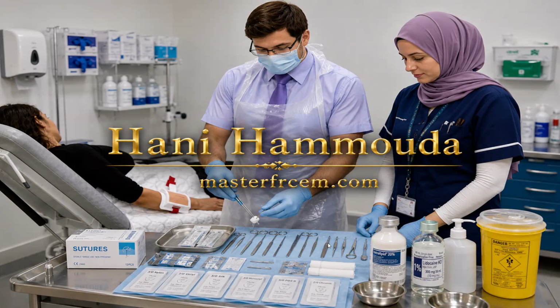Hold this forceps and put it on the middle of the wound. Ask the patient, can you feel here? You should verbalize. 5 minutes passed. Can you feel here, by this forceps? She or he will say no. It means you can do sutures now. Easy? Done. Until now in this station, you will not get more than 2 marks.